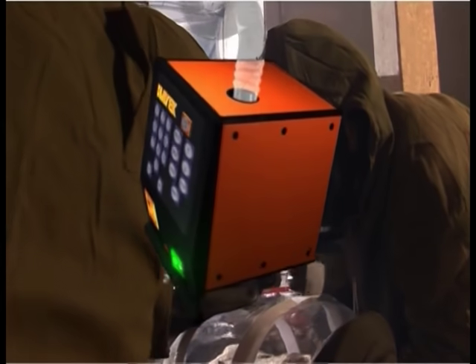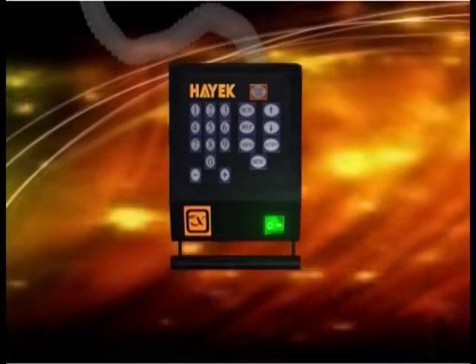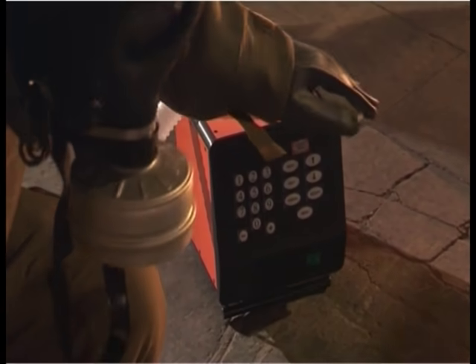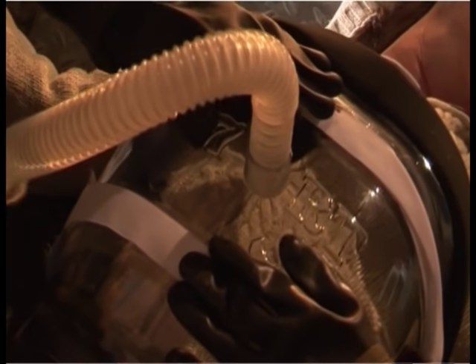The Hayek MRTX is easily portable, weighing only 2.5 kilograms, with a rugged casing for outdoor use. The rechargeable battery provides full ventilation for up to 4 hours and can also run on 12 and 24 volt, as well as on mains power.